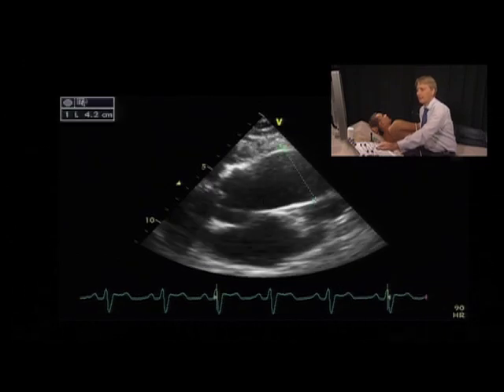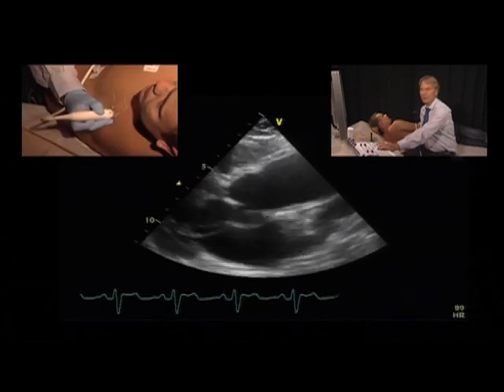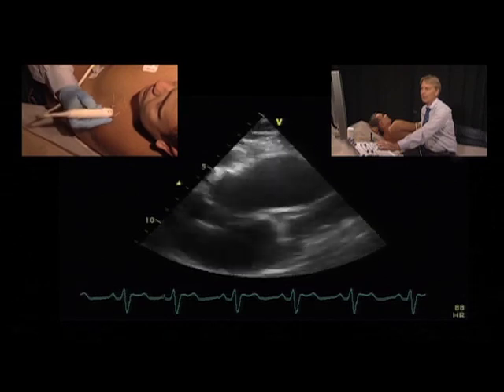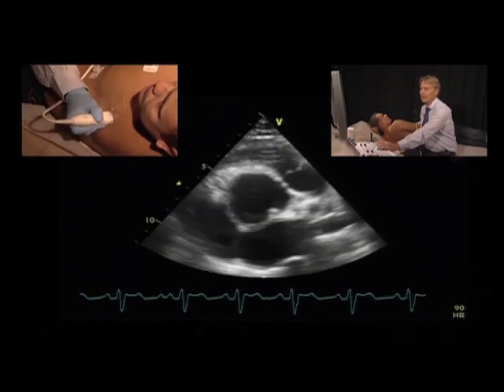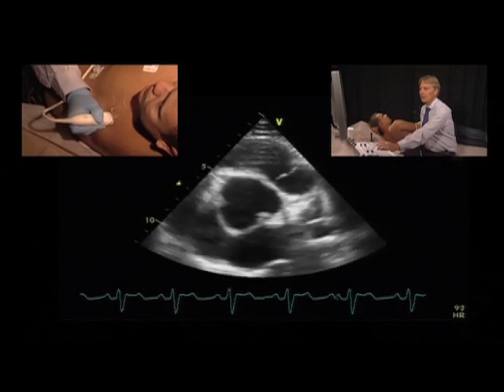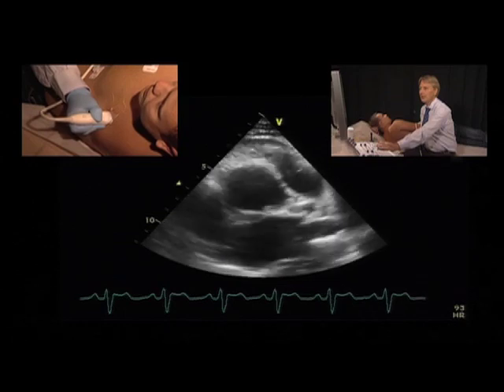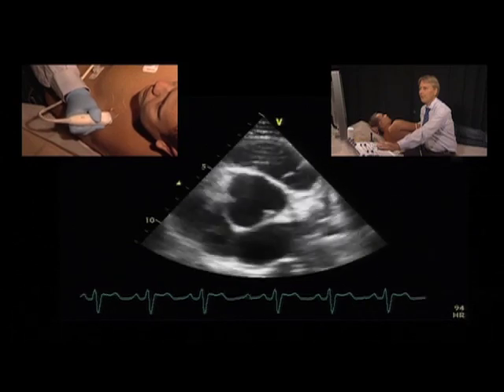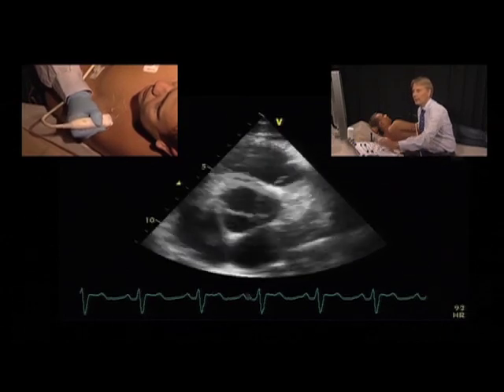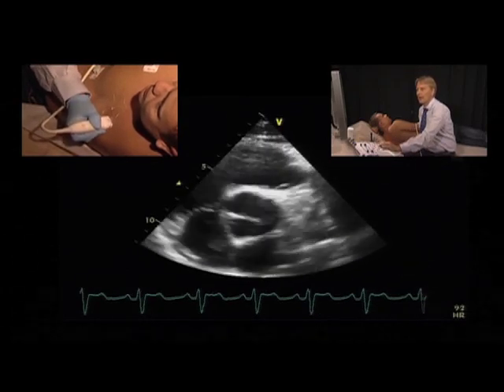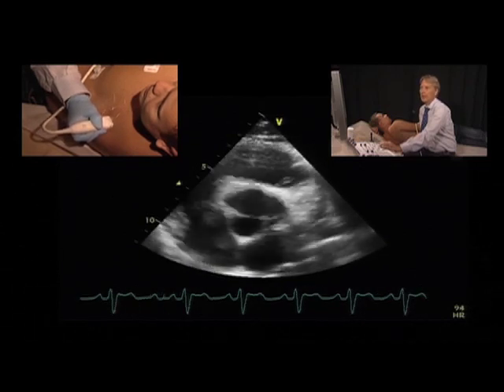This, together with the morphology of the valve, is almost indicative of a bicuspid aortic valve. We can exactly see the morphology of the valve here in the short axis view, and it is clear that the patient only has two cusps opposed to three. We also note that the valve opens quite nicely, and we do not have the impression that the valve is stenotic.